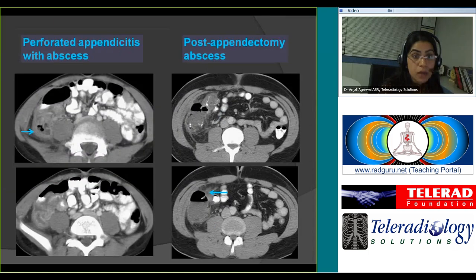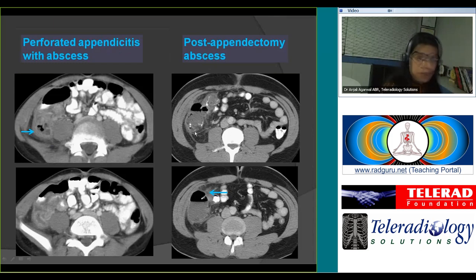Cases of perforated appendicitis: there is abscess formation and a lot of inflammation. You can see the thickened cecal wall and the terminal ileum, and this is a multi-loculated air-fluid collection. This patient had a recent appendectomy and developed an air-fluid collection in the right lower quadrant — a case of post-appendectomy abscess.